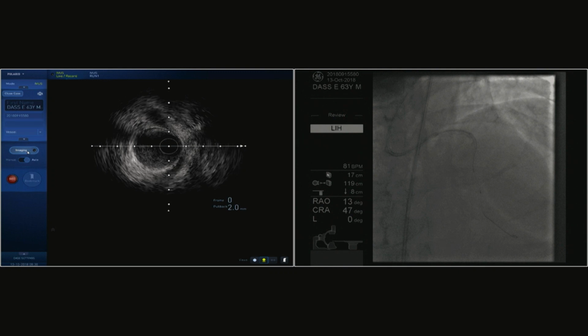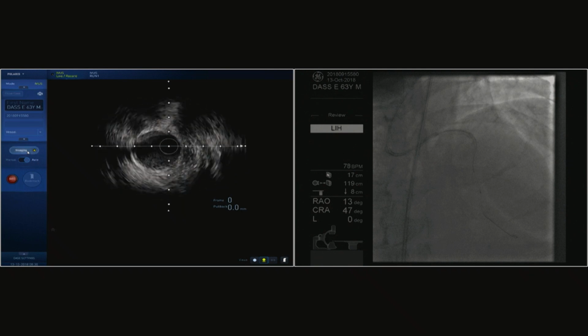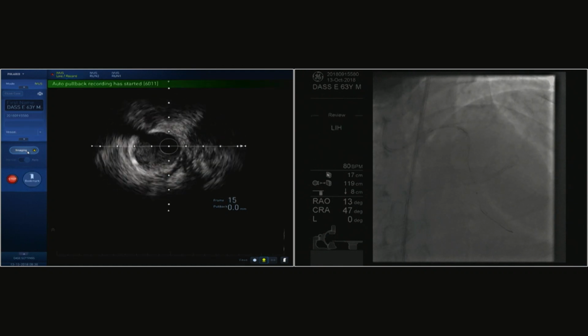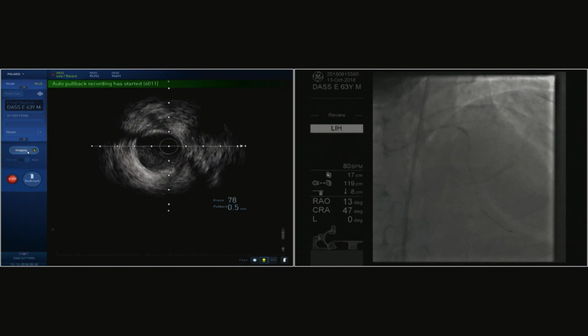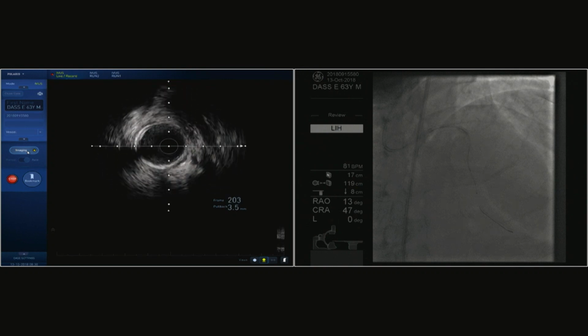Yeah, but the only point is that we choose an IVUS criteria or whatever. We choose 50% plaque burden in the rest of the coronary tree. But does the same rule apply to the left main as well? That is the point which we're going to show you now. We're going to show you the edges, yeah? And tell me if that was okay.